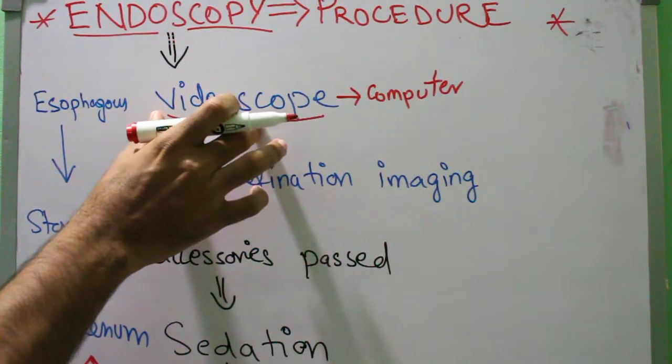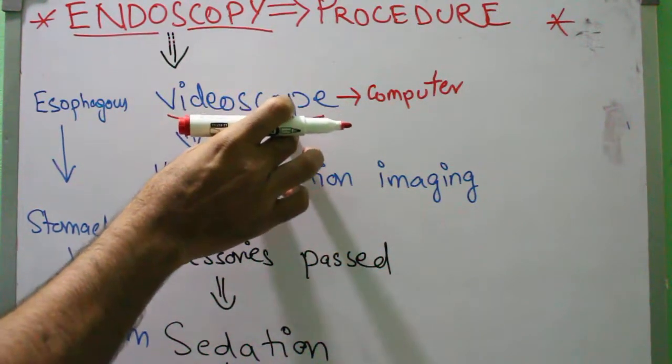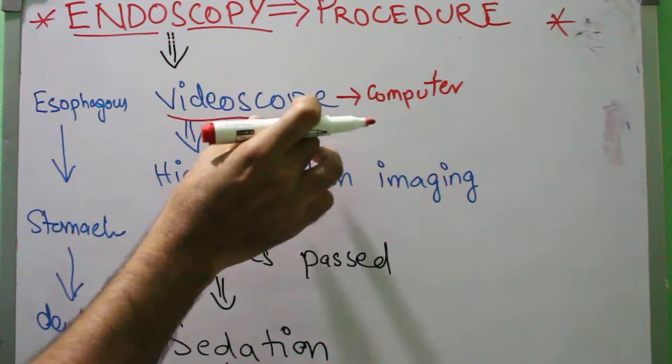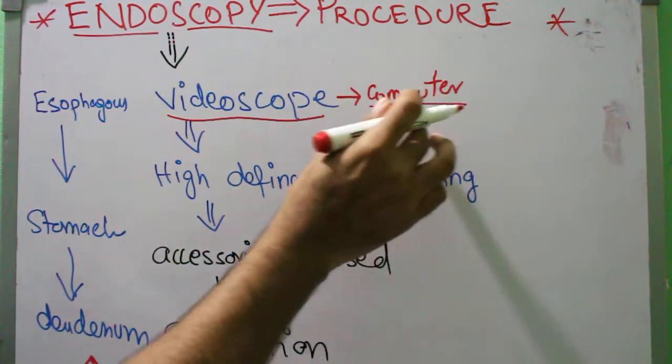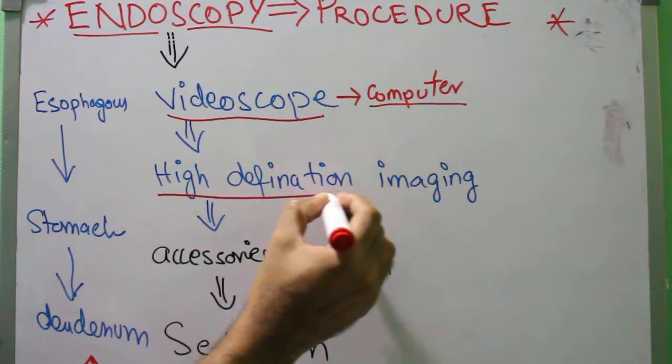A video of your stomach, duodenum, and esophagus. It is connected with the computer, and the videoscope starts. Now the high definition imaging procedure.